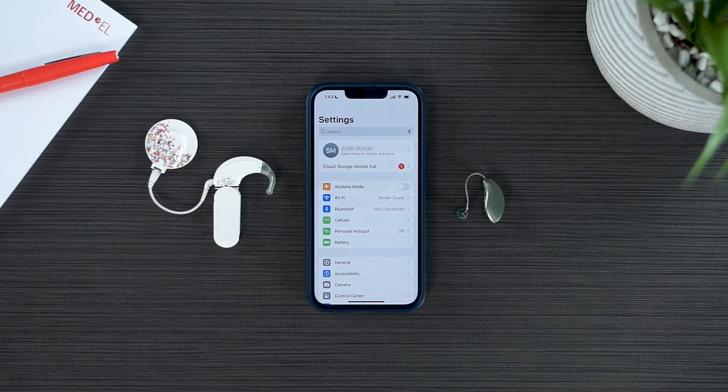DualSync allows you to stream to both your Starkey hearing aid and Med-El audio processor simultaneously. Let's start by pairing your Starkey hearing aid to your Bluetooth device.